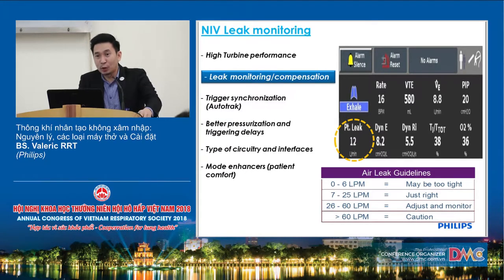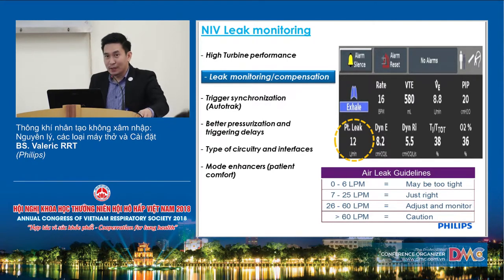What you can monitor is the total, not the patient. If you're using Philips, you can monitor the patient leaks directly. Okay, so any questions? Okay, so my next slide, my last slide, is the modes of ventilation.